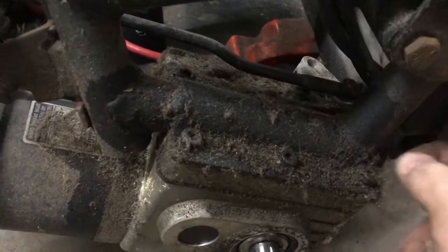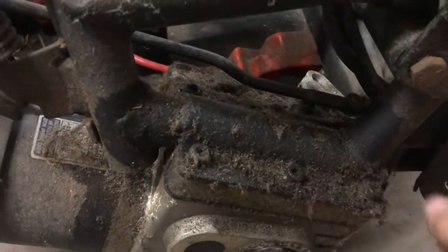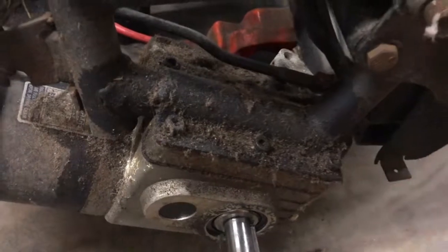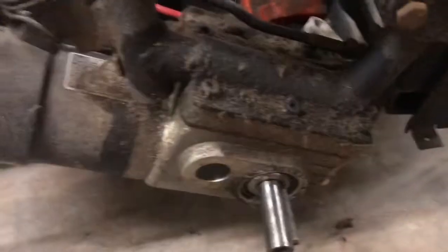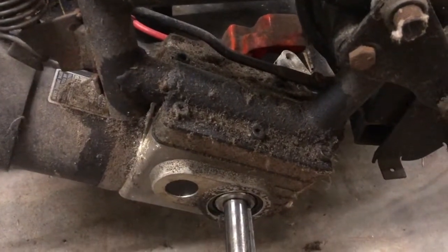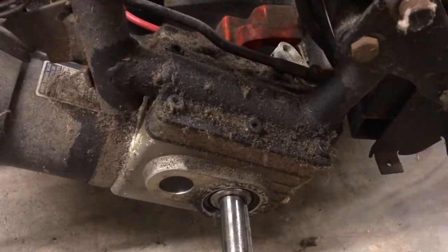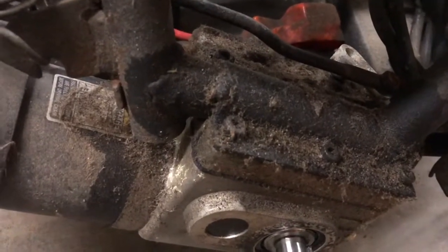So this should be a 5mm, I'm sure. There's actually a lot of grease on this. That's actually normal after a certain amount of time, because eventually grease will turn into a thinner liquid and will just naturally pour out. So every once in a while, I take my cover off, dump the grease out, which is usually like water, and then I go to the auto parts store and just throw some grease in there, and I'm usually good to go. Typically on wheelchairs, I don't hear of anybody who does that.